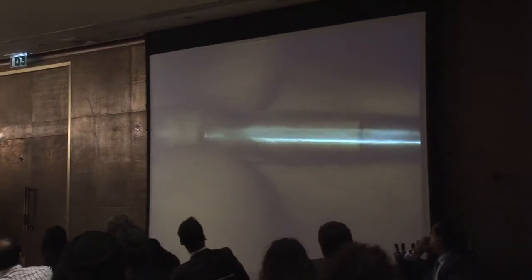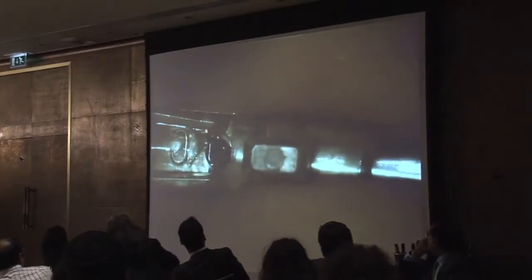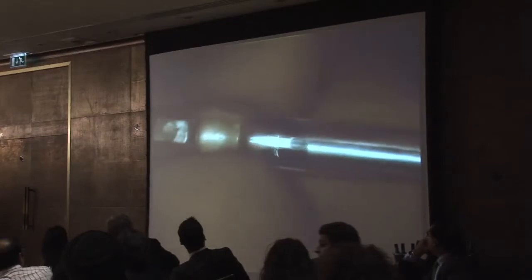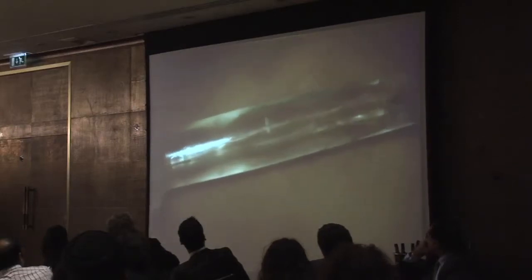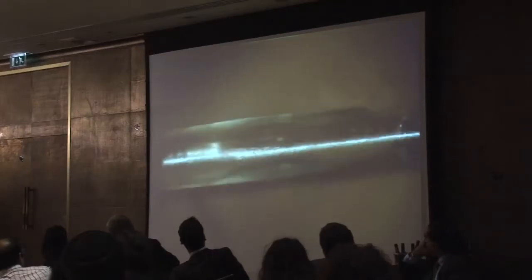Under the microscope, the ICL can be pulled into the tip of the cartridge with a bended forceps. In this way, the ICL is nicely stretched in the tip and can be delivered during surgery without problems. So you bring it to the forefront of the cartridge and then you dock it into the injector.